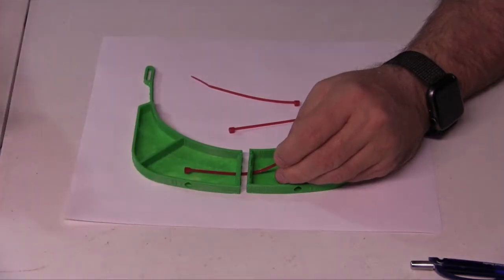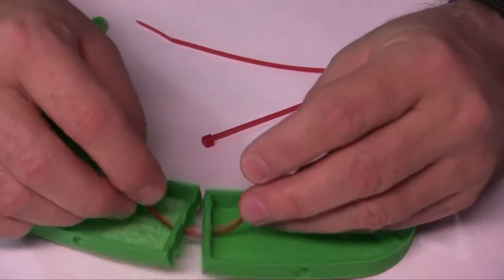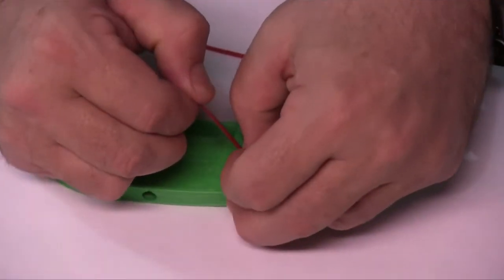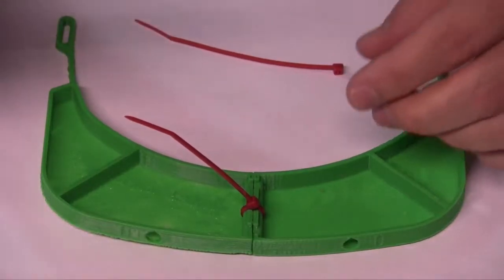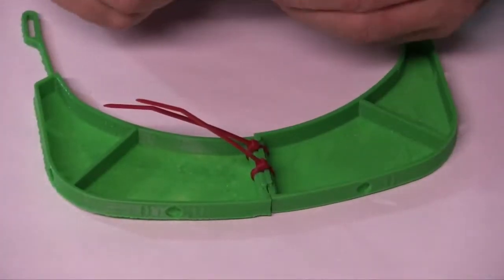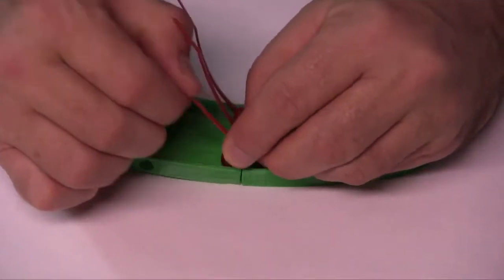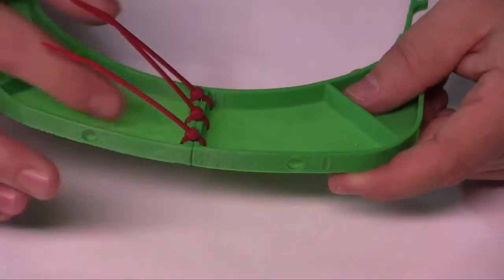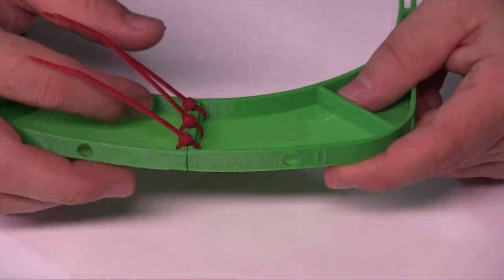And let's zoom in a little bit. So we have these two pieces with the zip tie going through them, and then we fasten the zip tie, and right now those pieces are connected right there. Now to make this extremely secure, we do two more. And we'll see that right now the two pieces are securely fastened to each other with three zip ties. The indents on the top of these right here allow for the zip ties to sit there.